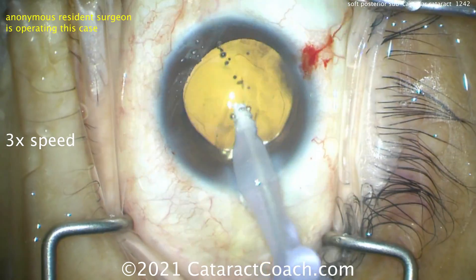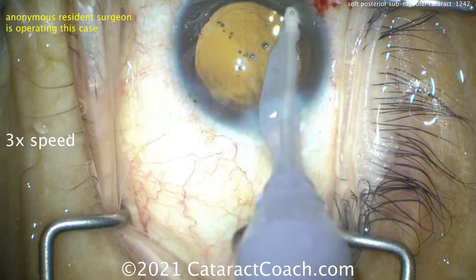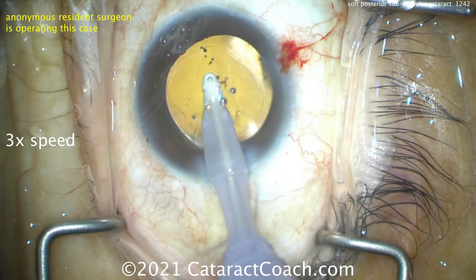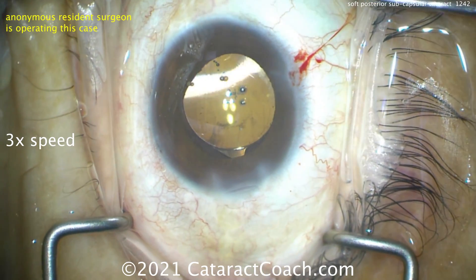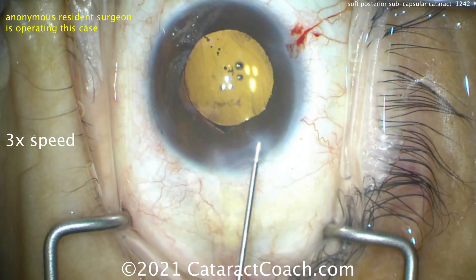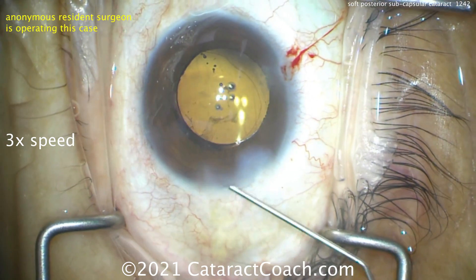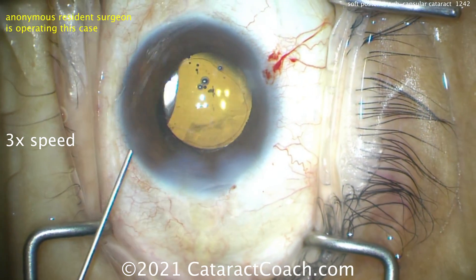Look at that rhexis now — that's a six millimeter optic on the lens. The rhexis in one dimension is probably only four millimeters and the other maybe about five and change, and still we were able to easily prolapse that nucleus out of the capsular bag in this case. Definitely for soft posterior subcapsular cataracts, your best move is to prolapse it out of the bag — get that thing in the safe zone.